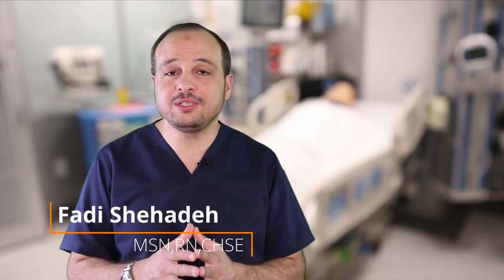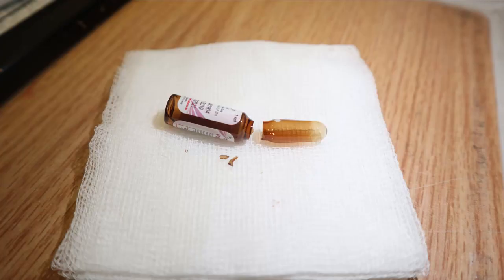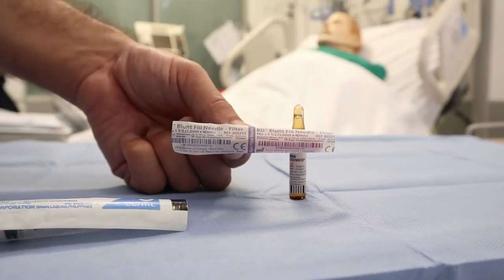When you prepare ampule medications, there is a possibility for small glass particles to be in the ampule. We will use the filter needle to prevent these small parts from going to the patient. Here we'll go step by step on how to use the filter needle.